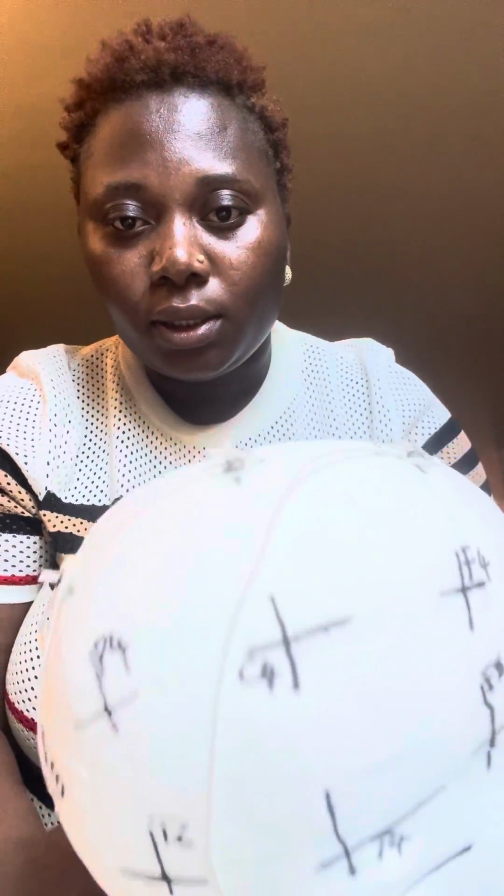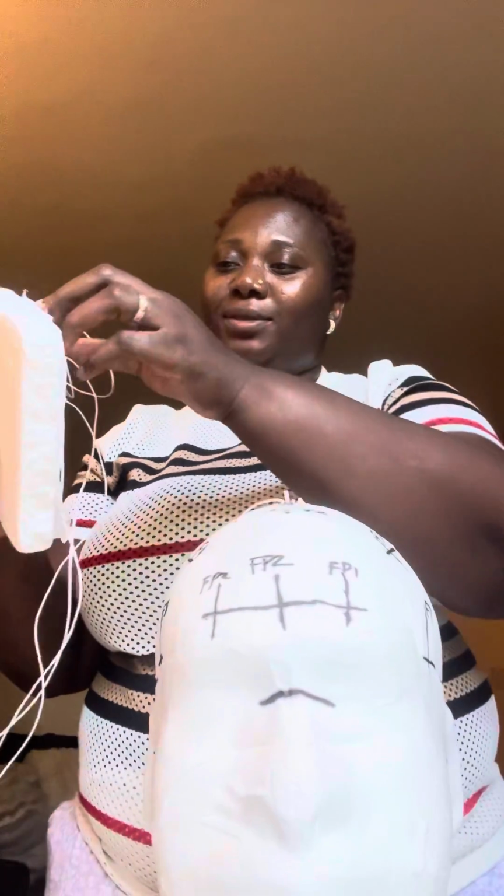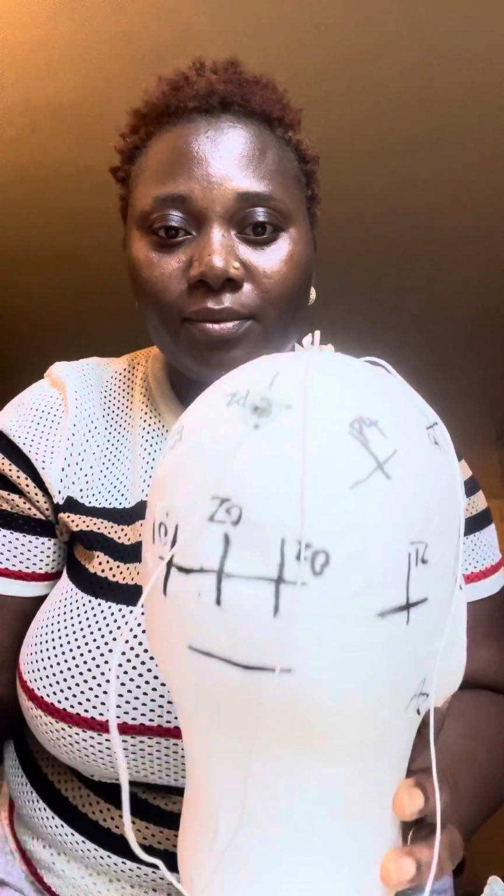Okay, these are the measurements I got. All right, this is the International 10-20 system, EEG. Okay, my head box. Thank you.